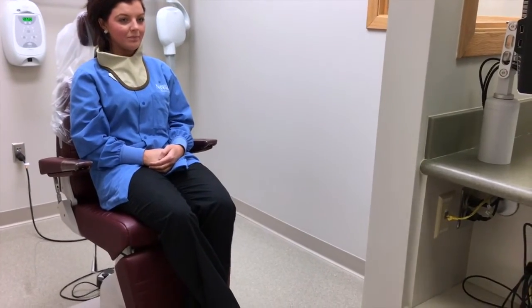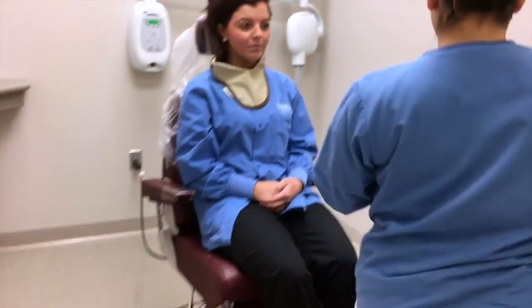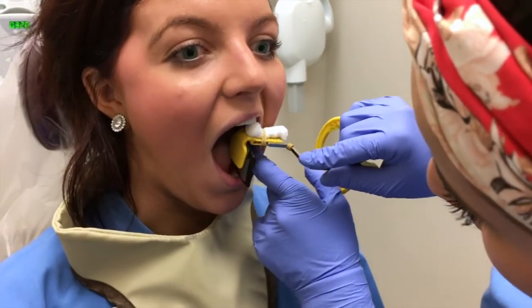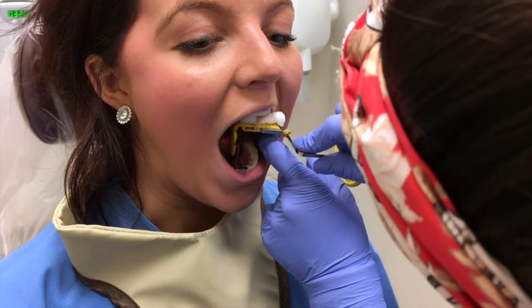We will now show a molar periapical film being taken. For a molar periapical, you want to be sure to capture distal to the last erupted tooth.